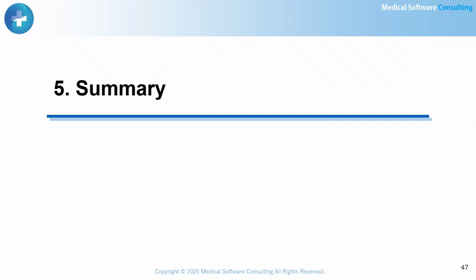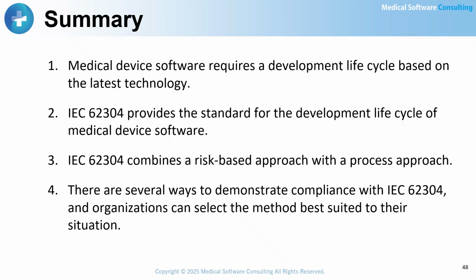Section 5. Summary. Let's wrap up with the key points. First, medical device software requires a development lifecycle that reflects the latest technology. Second, IEC 62304 provides the standard framework for managing that lifecycle. Third, IEC 62304 is unique in that it combines a risk-based approach with a process approach. And finally, there are several ways to demonstrate compliance with IEC 62304. Each organization can choose the method that best fits its own situation.